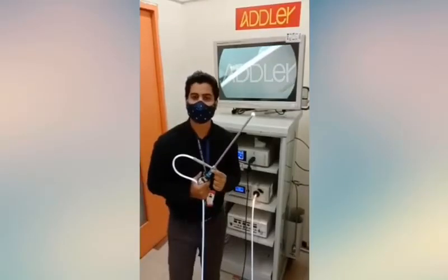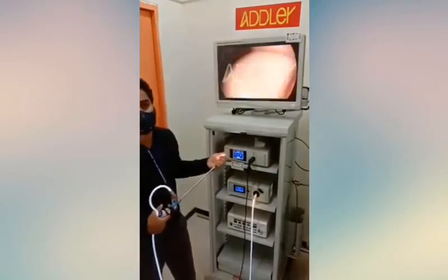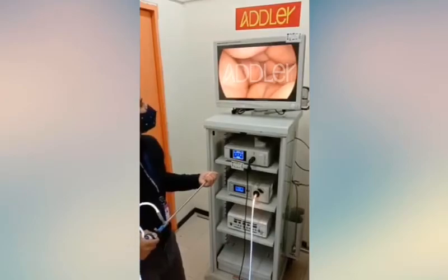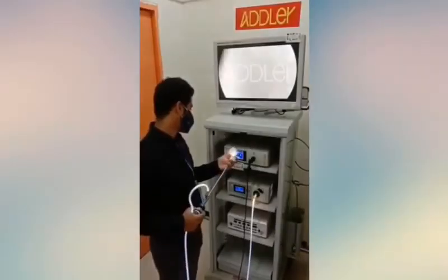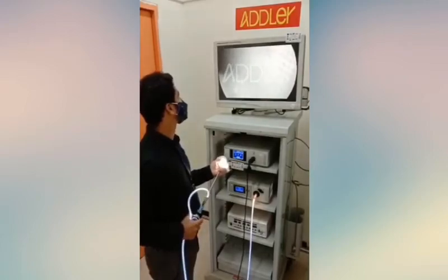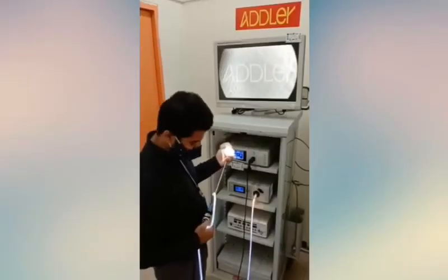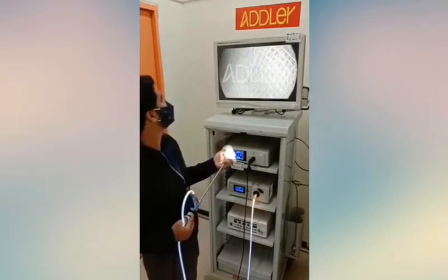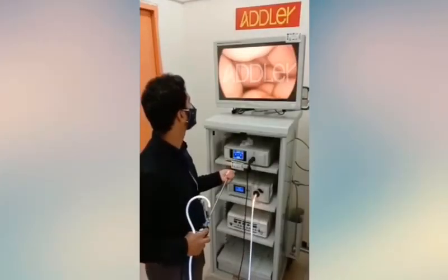This is a Stryker 10mm 0 degree scope. Let's see how the image looks on the monitor. Now we're doing the white balance — long press the W button on the hand piece. The monitor shows white balance complete, and now we can see the true colors.